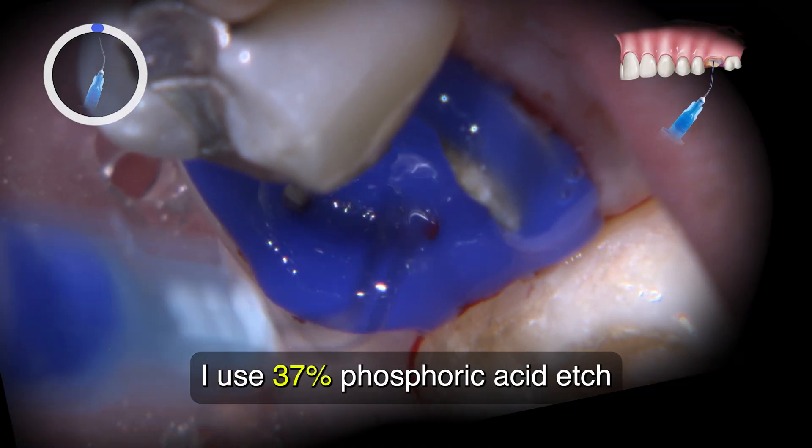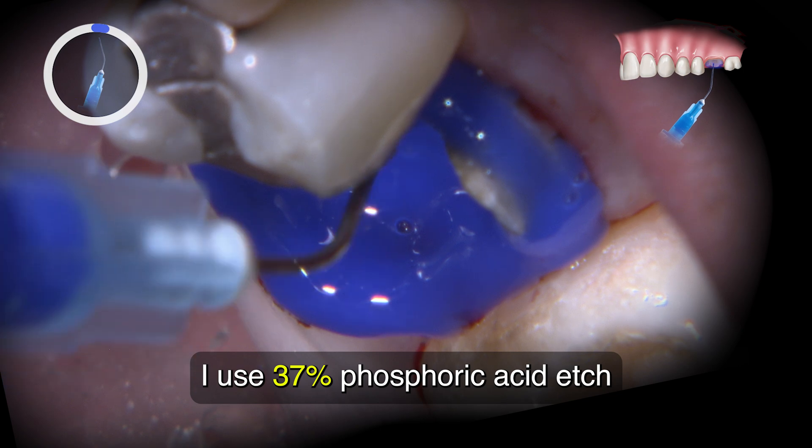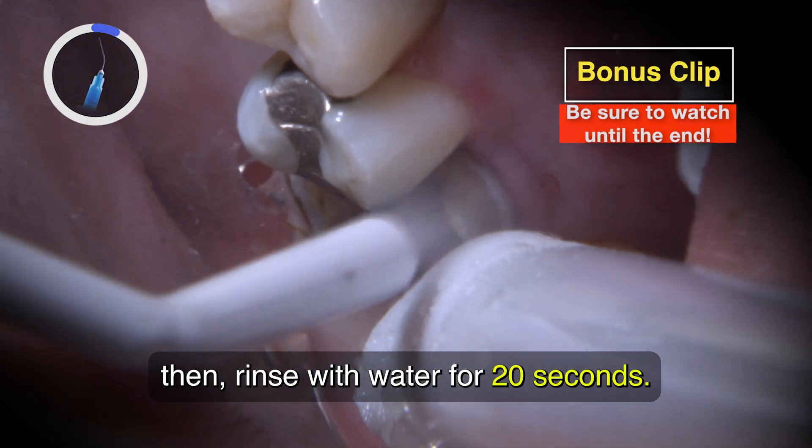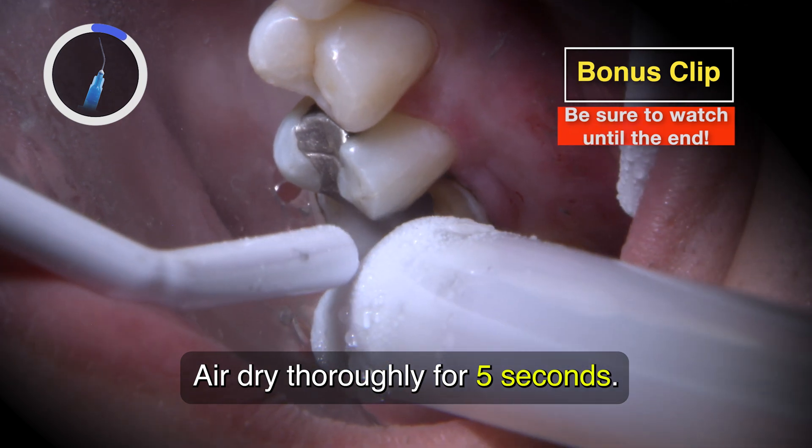To do the buildup, I use 37% phosphoric acid etch for 15 seconds on the enamel and dentin. Then rinse with water for 20 seconds and air dry thoroughly for 5 seconds.